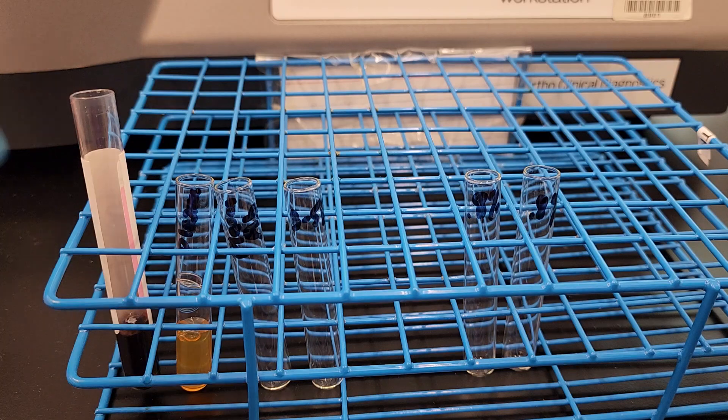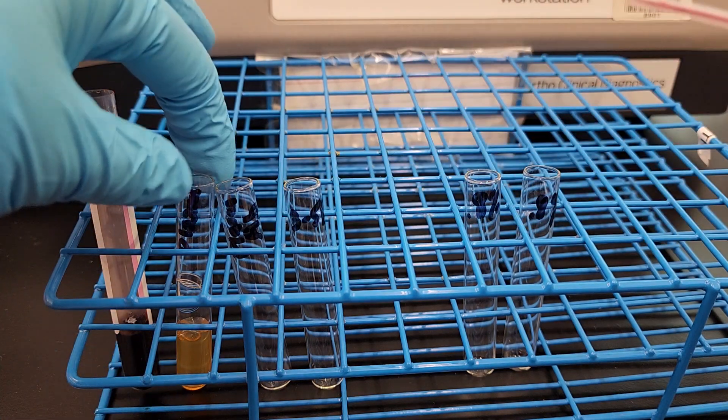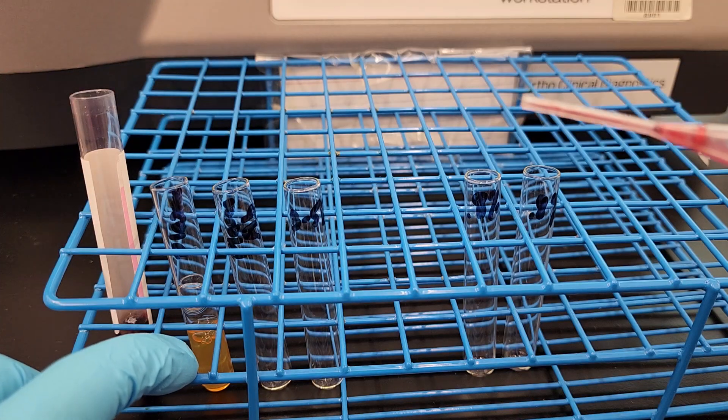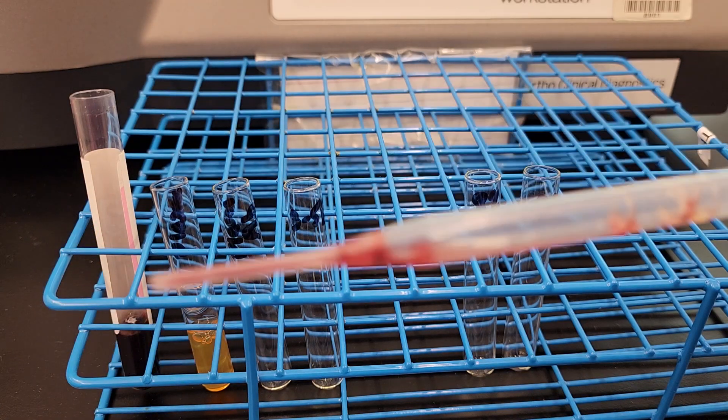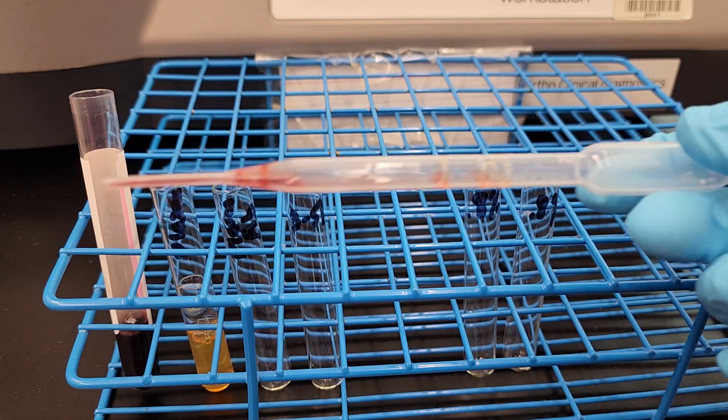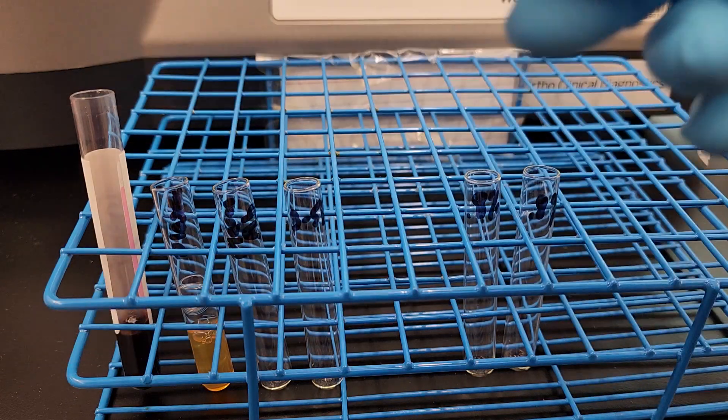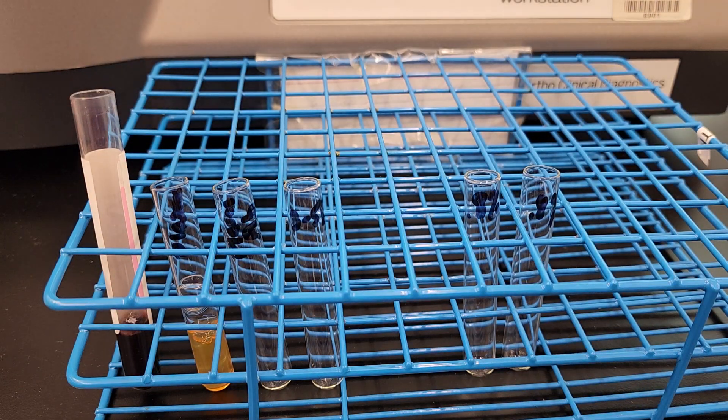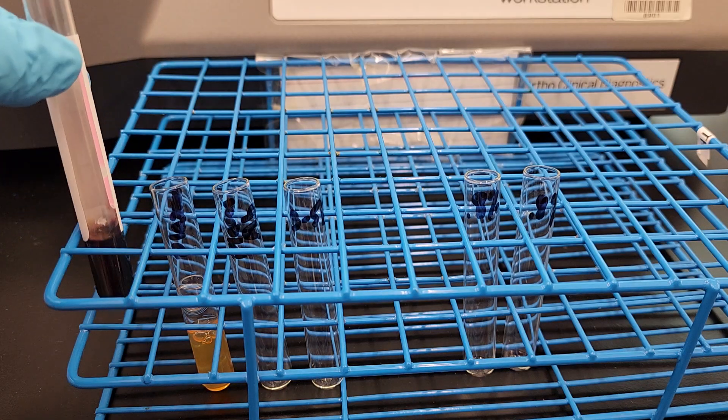So what you could do is if you put these red cells in there, you could spin it down and pull off the plasma that way, put it in a fresh tube. Or you could have not put it in there in the first place and just throw it away like I'm going to do. So that went in the red trash can. All right, so now I have my packed red cells.